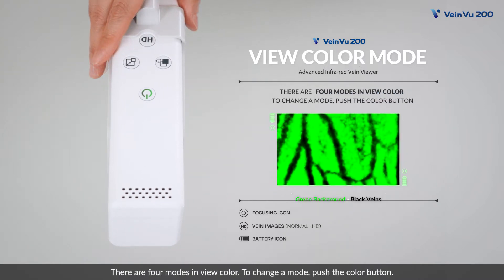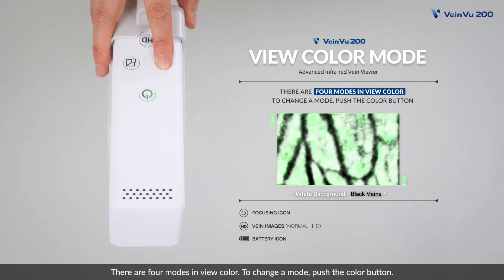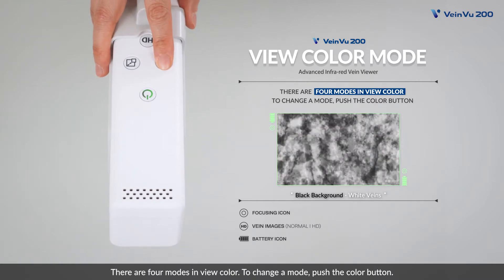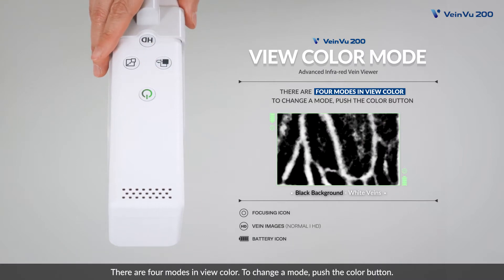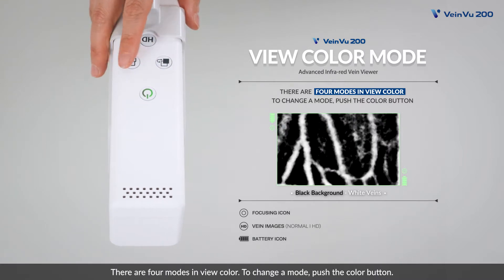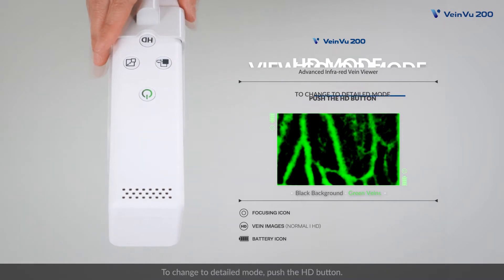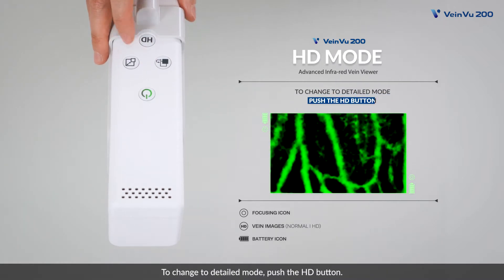There are four modes in view color. To change a mode, push the color button. To change to detailed mode, push the HD button.